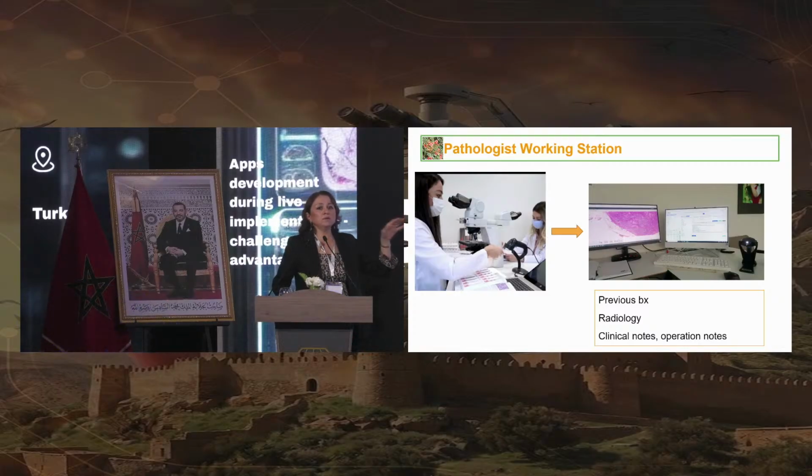As you see on the left, at the COVID time, we started a short time with microscopes. Microscopes are historical on our table for now. When there is a crisis, nobody wants to use microscope, and everyone says, scan my glass slides, please.